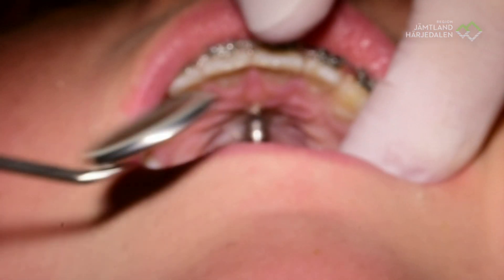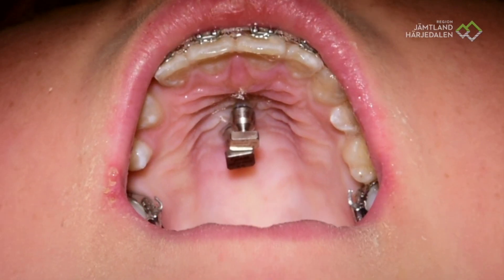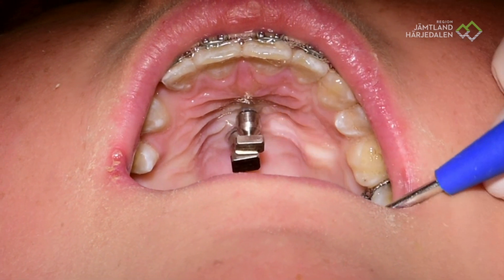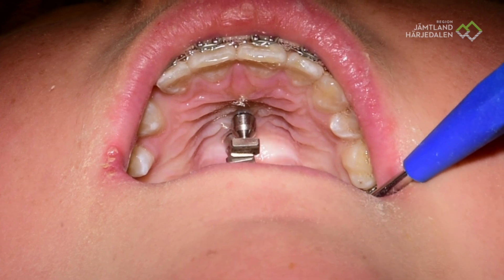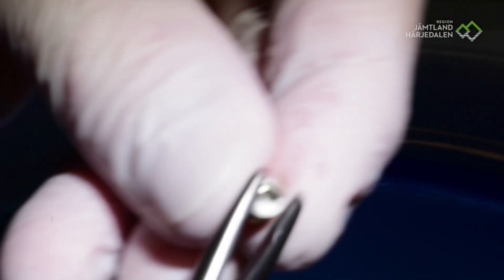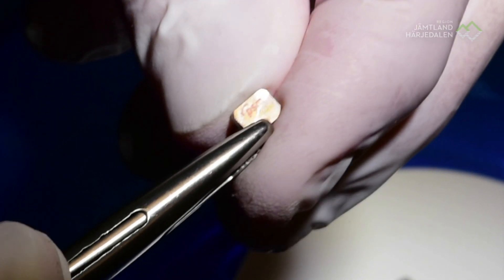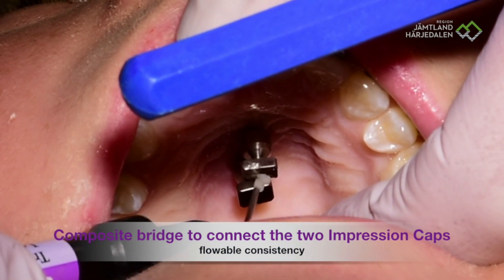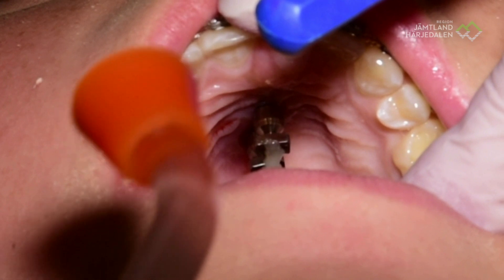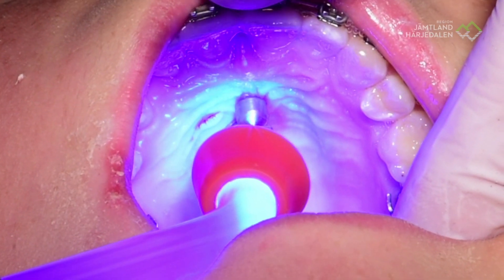I should see a little bit of space between them. If there is no space between them, I have to grind one of them. But if the position of the two screws is perfect, then you will see a very, very small space between them — this is perfect. It means the distance between the two screws is optimal — not too wide, not too close. I am doing a cement bridge between the two impression caps. This will help to stabilize them in the right angle so they do not destabilize while taking the impression out.